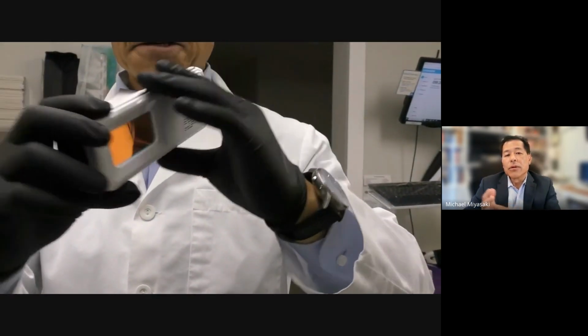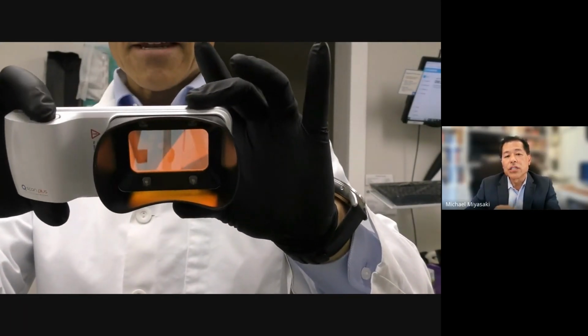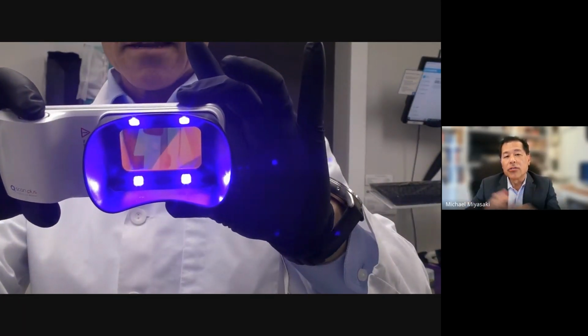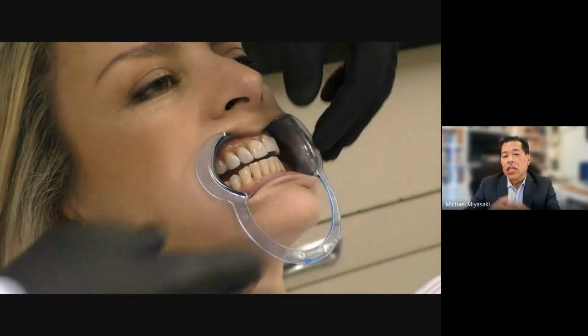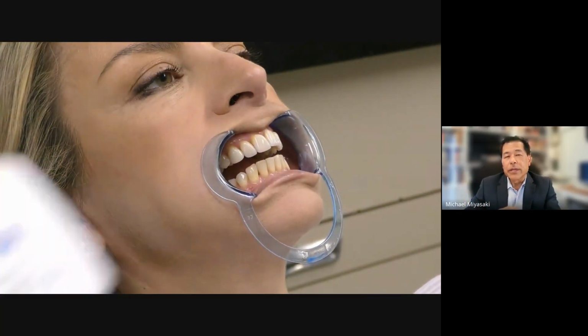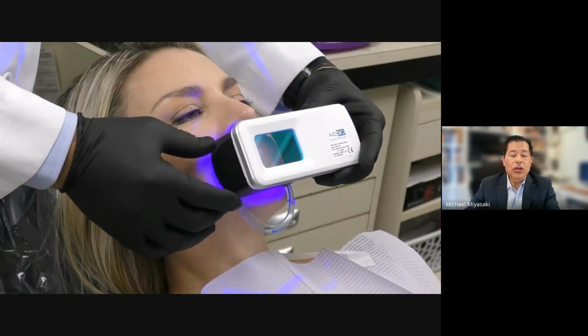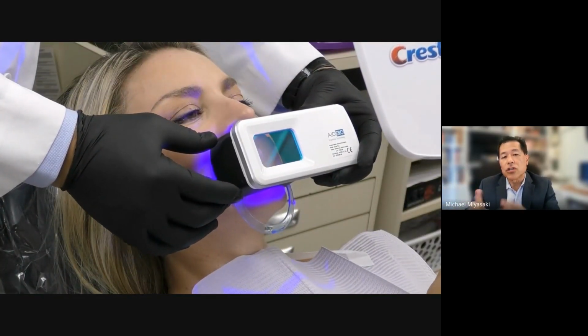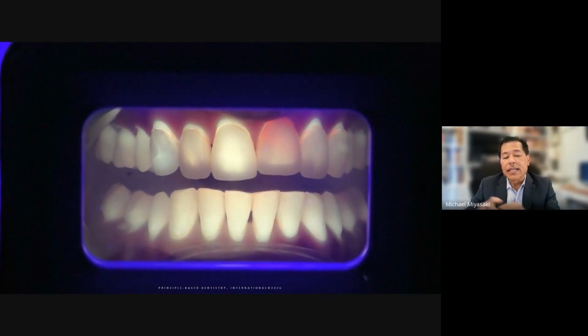And then the other tool is just the QScan Plus. Again, we've shown this where it's a little handheld, very low-cost way of working with patients. This using retractors here, but you can have the patient use this at home. You can have them use it in the office, so you can start to get into using this technology. But if the patient holds a mirror, they can see the red. They can see the red around the gums, red around the margins, and areas of concern, and we can explain that to the patient.